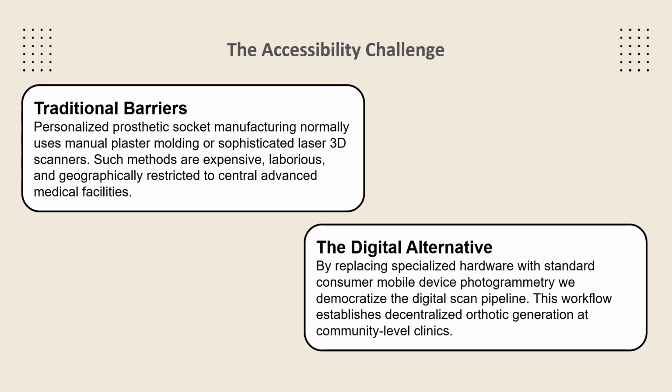Plaster molding is laborious, uncomfortable for the patient, and dependent on operator skill. Conversely, optical laser scanners are prohibitively expensive, thousands of dollars, and require special operating software, which isolates the design pipeline to centralized, advanced urban medical facilities.